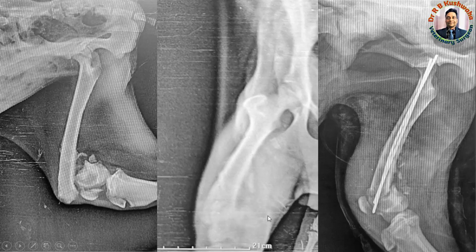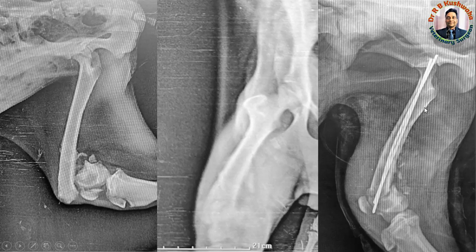This is the view immediately after dynamic cross pinning. You can see how beautifully this distal segment is also aligned with the proximal fracture fragment. The proximal tibia is visible, and the patella is nicely placed over the trochlea.